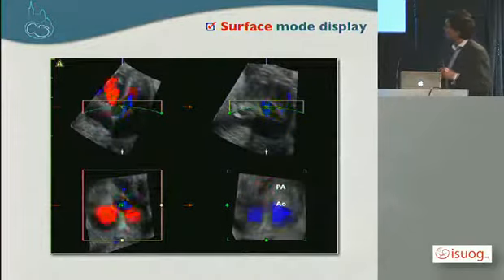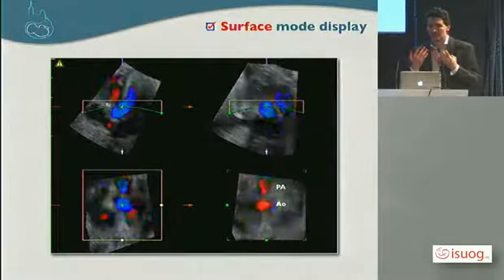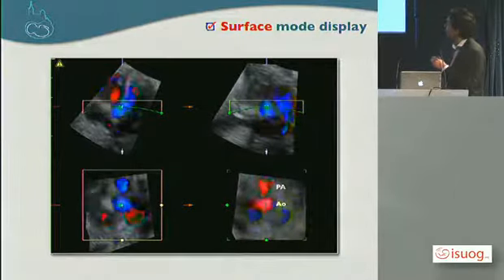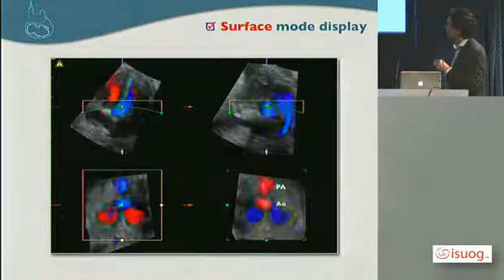In the normal fashion, you have here a coronal plane, a frontal view of the heart of the baby. Here this is the left side, this is the right side, here this is the diaphragm, and here will be the head of the baby. Here you can see at first the aorta, and then just above it the pulmonary artery.